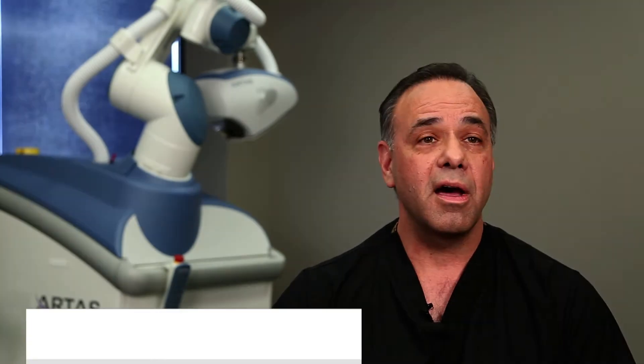The SAFE System is a method of removing grafts one at a time that I implemented about 13 years ago, and it uses a blunt punch dissection system. Basically, a blunt tip that does not have sharp edges can envelop the follicles and remove them from their surrounding tissue with minimal trauma — minimal trauma to the skin, minimal trauma to the follicles themselves.